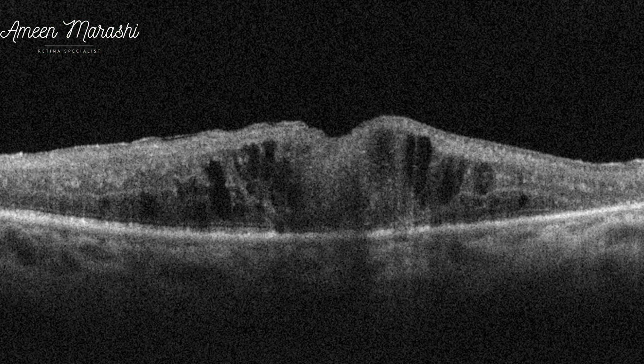This is a case of diabetic macular edema in a pseudophakic vitrectomized eye from 2 years ago. The OCT cross-section shows cystoid macular edema.